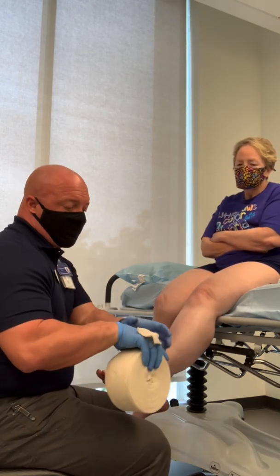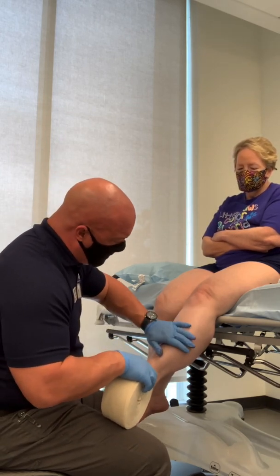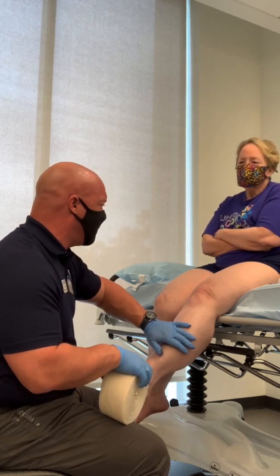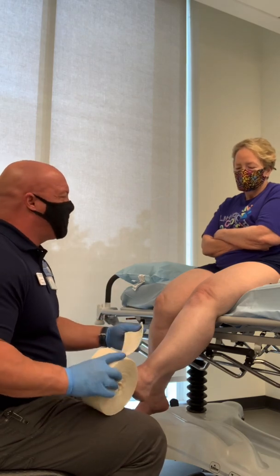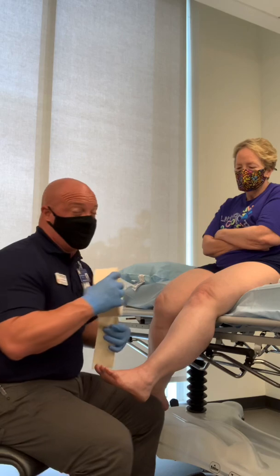This is the largest diameter we have of compression stockinette. Usually, a leg of this diameter, I would probably use 4, if not 5-inch compression stockinette, but we're going to make this work today. Because of the diameter challenges, we're going to measure a little bit greater than we normally would.